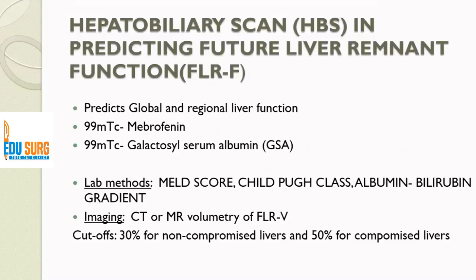The commonly used radiopharmaceuticals are technetium IDA derivatives, which is the mebrofenin, and the second one is the galactosyl serum albumin. Galactosyl serum albumin is only available in Japan. So I will be talking more on mebrofenin today.